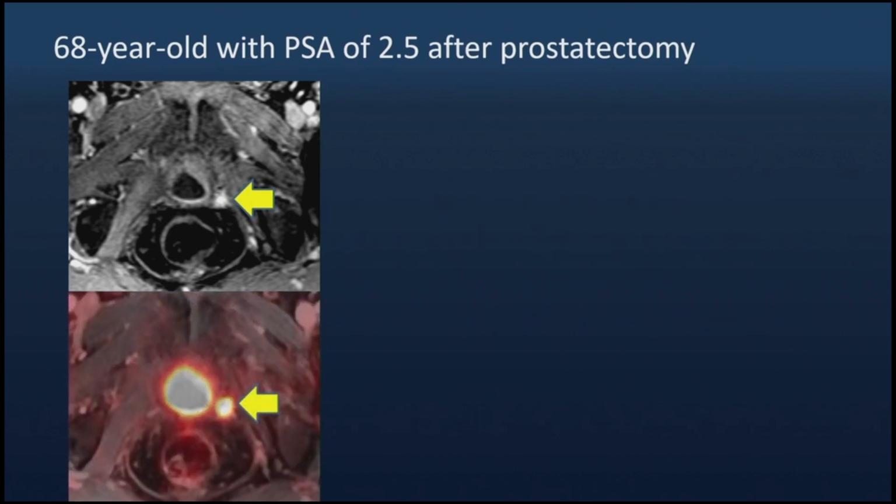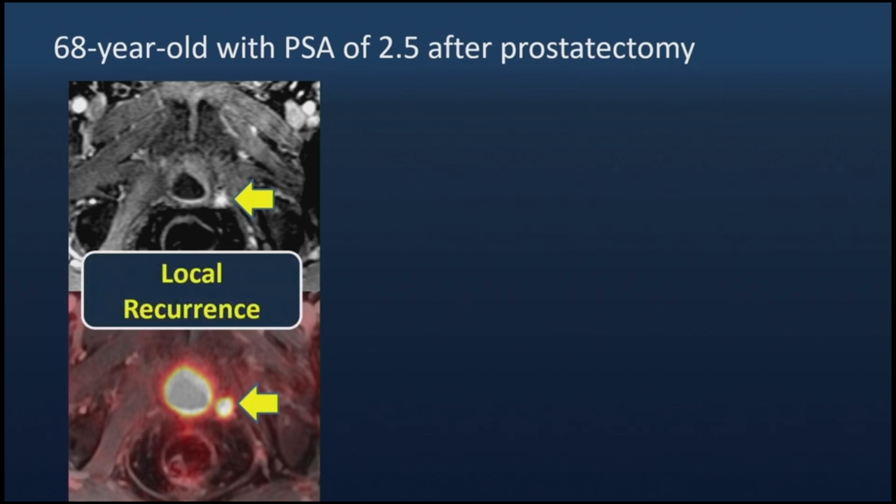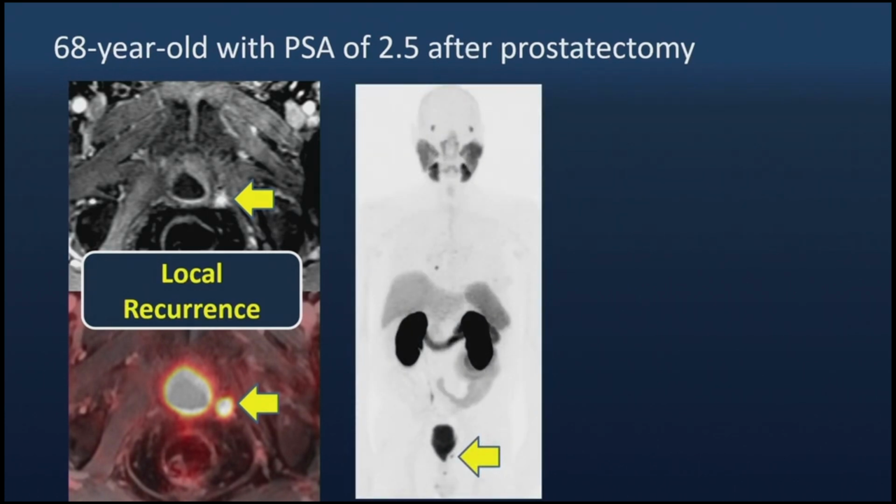Here's the MR showing, here's the PSMA PET showing concordant uptake. This can be really helpful. Sometimes we look at subtle areas, but we see this intense area. When we see matching, it makes our confidence very high. But again, what is it very helpful in terms of looking for? Systemic disease. So something here really changed the patient management.